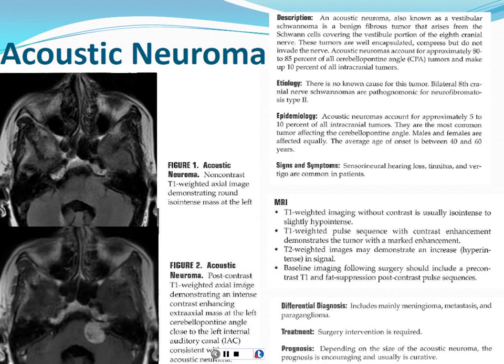Usually, before the patient comes in, they know based on the symptoms, the cranial nerve symptoms, that this is what they're looking for. But sometimes, it's a surprise, and they're not sure. And so, if you see one in there, maybe just check with the radiologist, make sure they're getting enough imaging through it to give them a definitive diagnosis of which one it is. Because this is one we can actually sort out by imaging. The symptoms that people will have is hearing loss, ringing in the ears, dizziness, because it's involving those nerves that go to the ear. And they will do surgery for this.